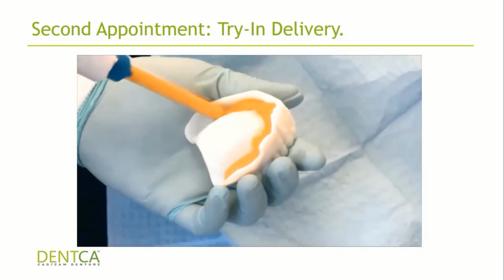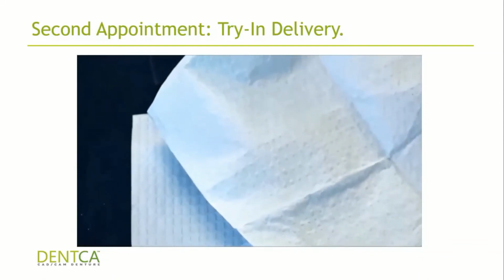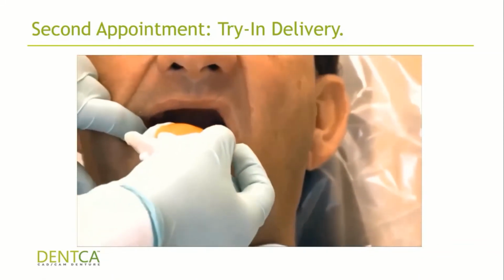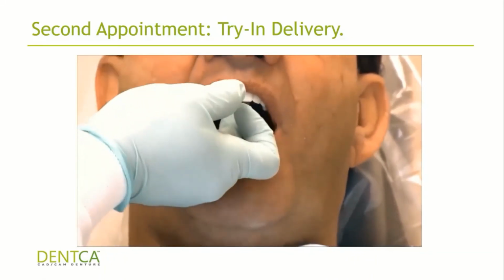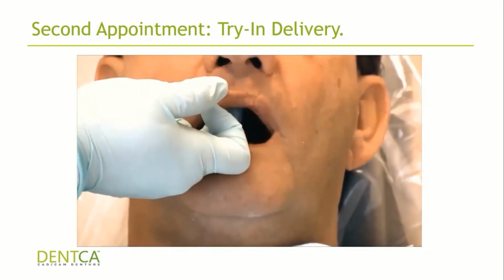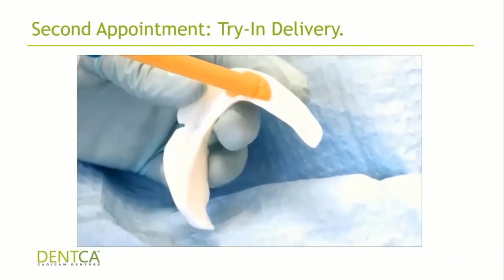Once you do the necessary washes, keep in mind that you don't really have to add a lot of material to it. It's usually pretty spot on. So if you add a small layer of material, it should be enough. Make sure you apply enough pressure so it seats all the way, and then you just do your border molding steps.